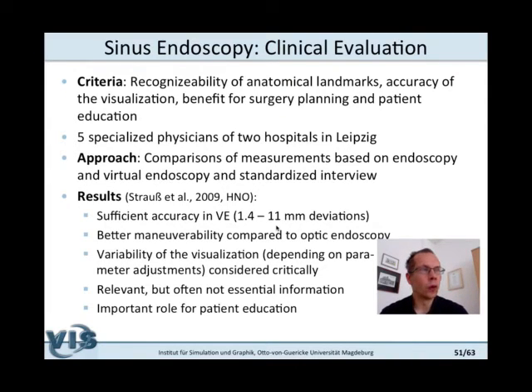So actually it is better if there is some agreement on some default values for a diagnostic procedure and not too much variability. If you have considerable variability in how something is carried out by different physicians, then you have also a varying quality in the results.